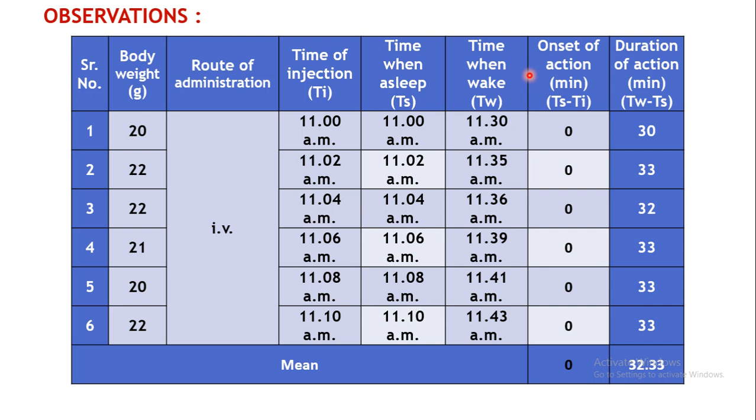Then next, what we are supposed to note down is the time when the animals wake up, that is denoted as TW.